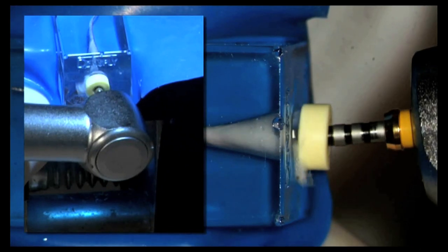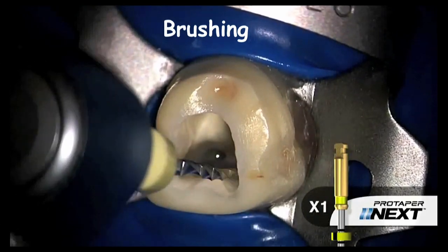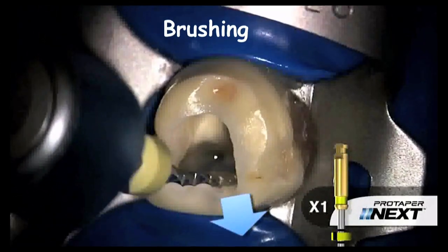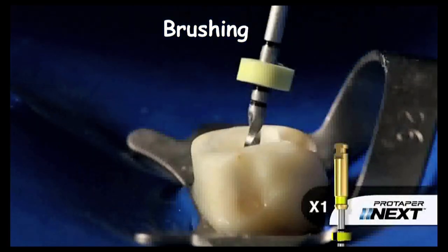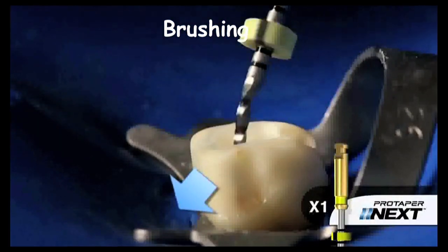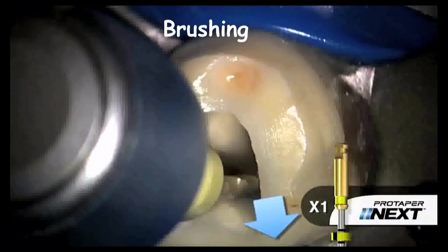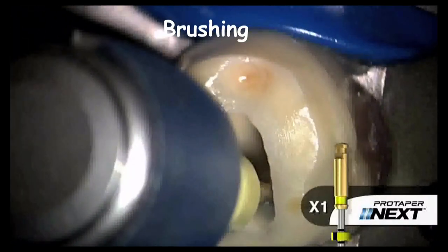And that is, I want you to remember that, because that is huge and a wonderful procedural technique that'll make a big difference. Then, of course, brushing. If you look at the arrows, you can clearly see with X1, paint, let it run, and paint, let it run. A lot of us are trying to get to that rubber stop as fast as we can, and enjoy it. Take your time. This is where you make the difference.